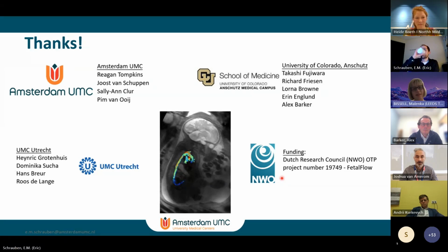Would you? Why is that? I'd be intrigued. I think because there are many other anatomical scans that would benefit from 1.5 Tesla. So in order to do these 4D flow segmentations, you often would like to have something on the side that is a more true representative of the anatomy than a spoiled gradient echo image. But yeah, I understand your question. At 3T, we definitely get more potential for signal, especially in these 4D flow acquisitions. So it's a trade-off for sure.